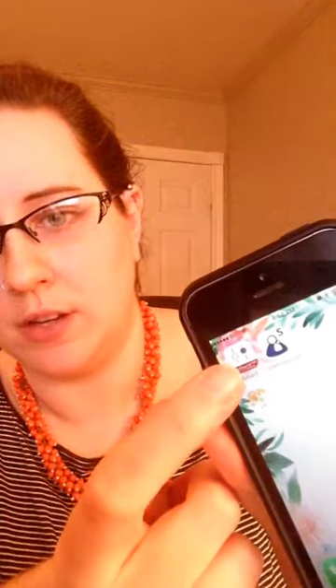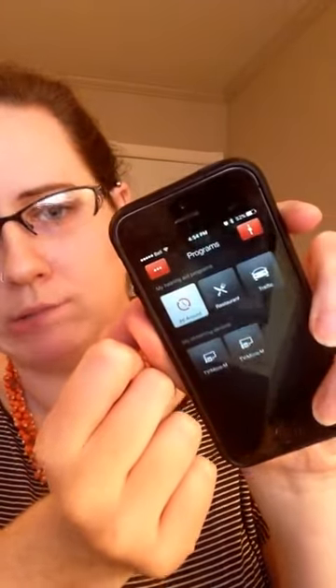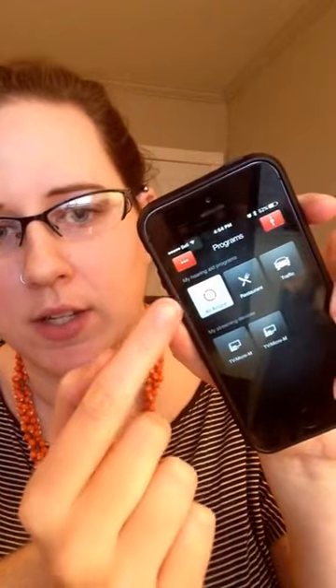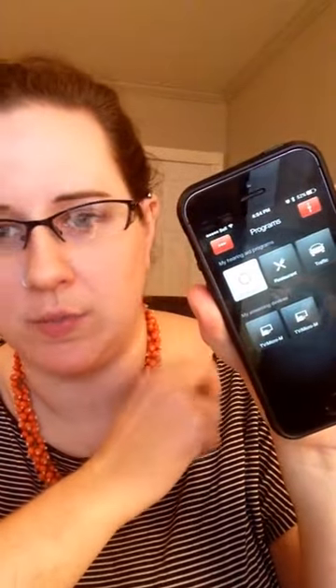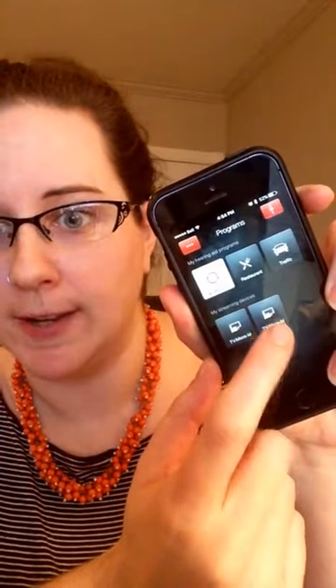The first thing you need to do is open your hearing aid app. When I open it — sorry about the glare — it looks like that. It's set to the all-around setting, which is just my general everyday hearing aid setting, and when I use the streamer I set it to the micro mic setting.